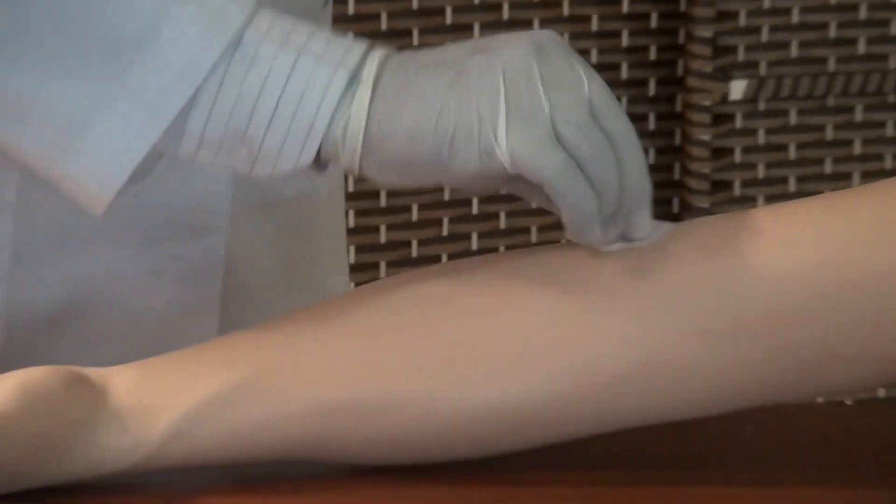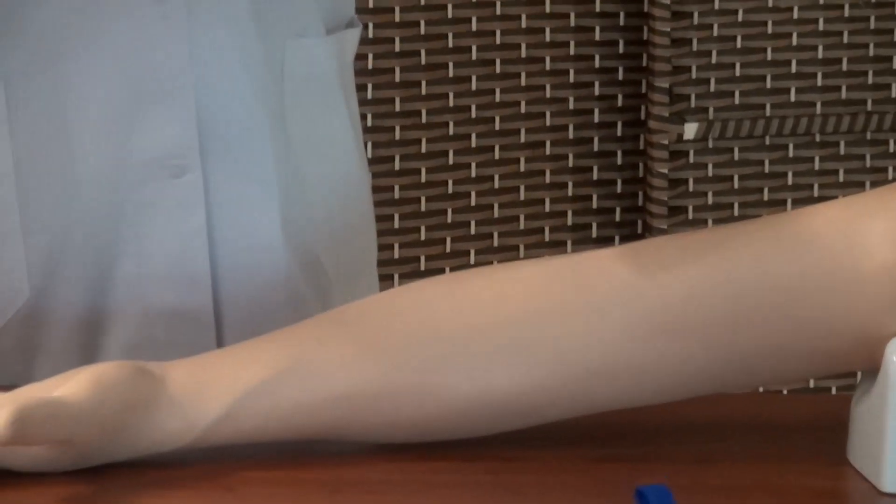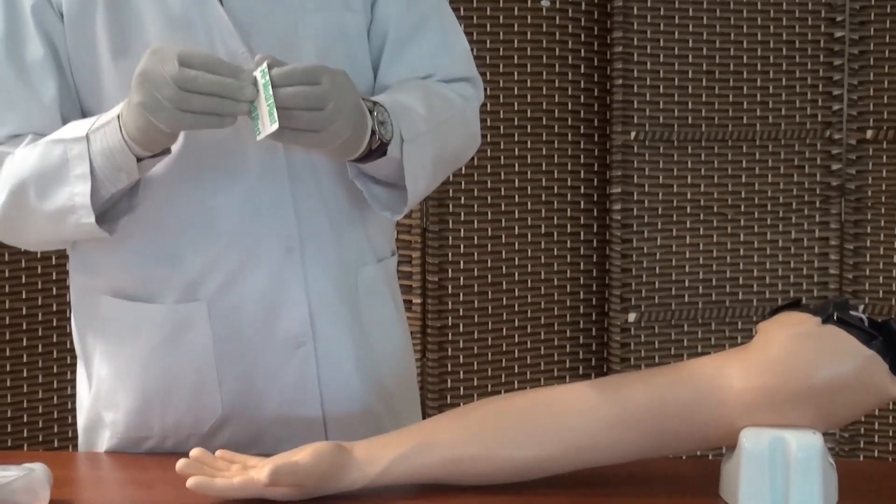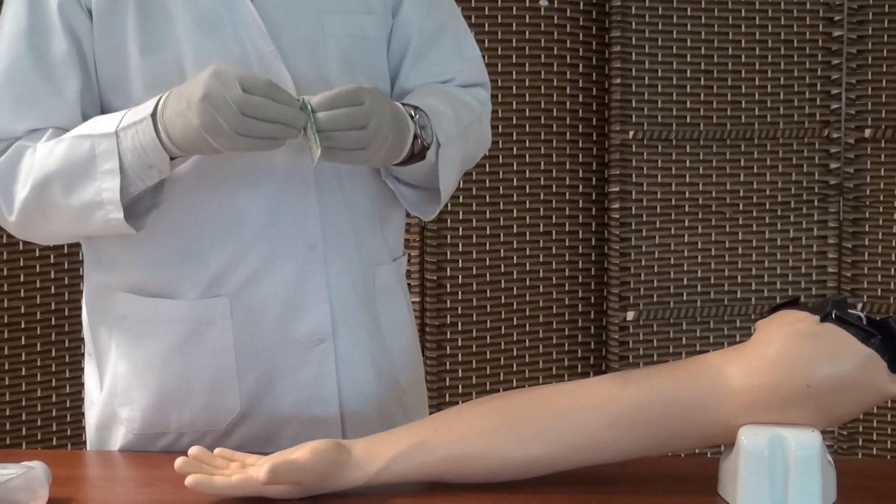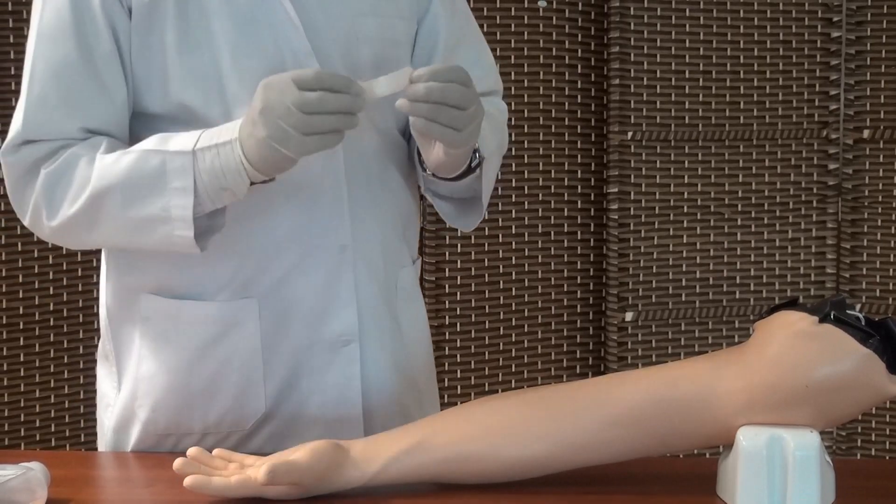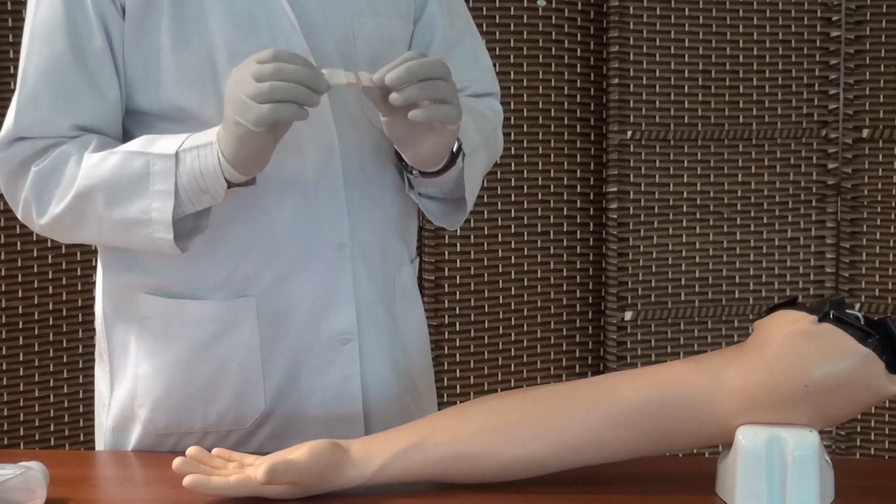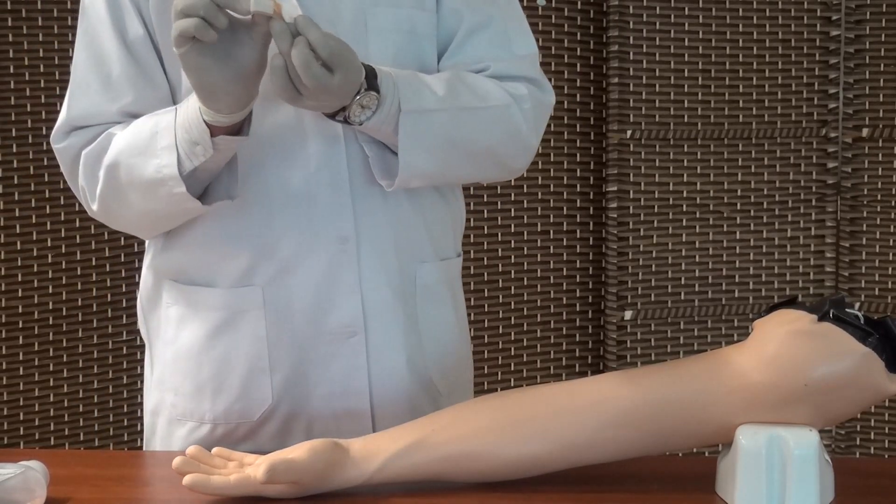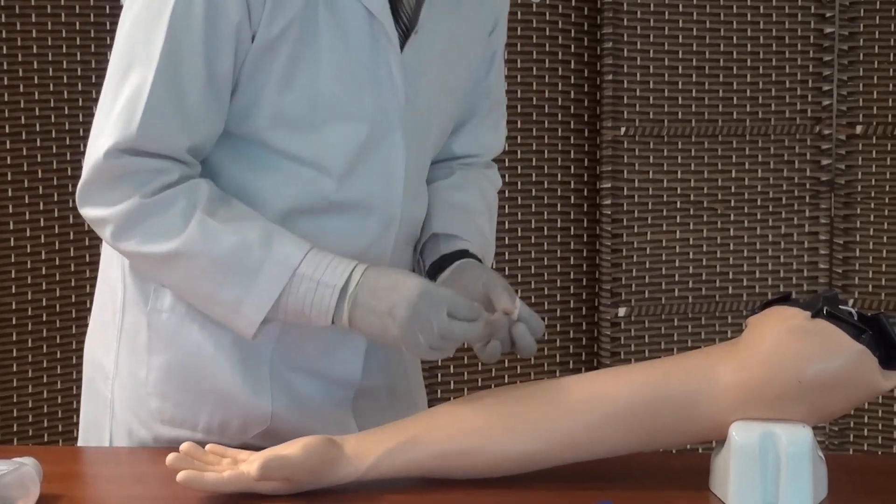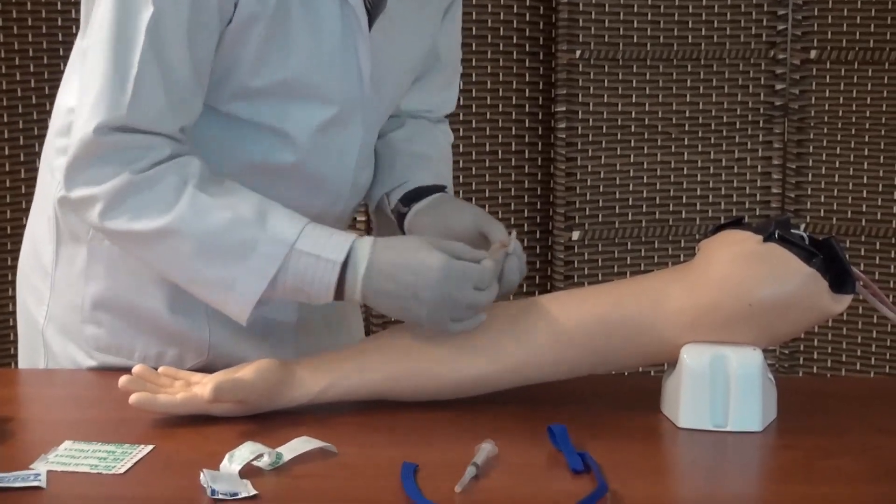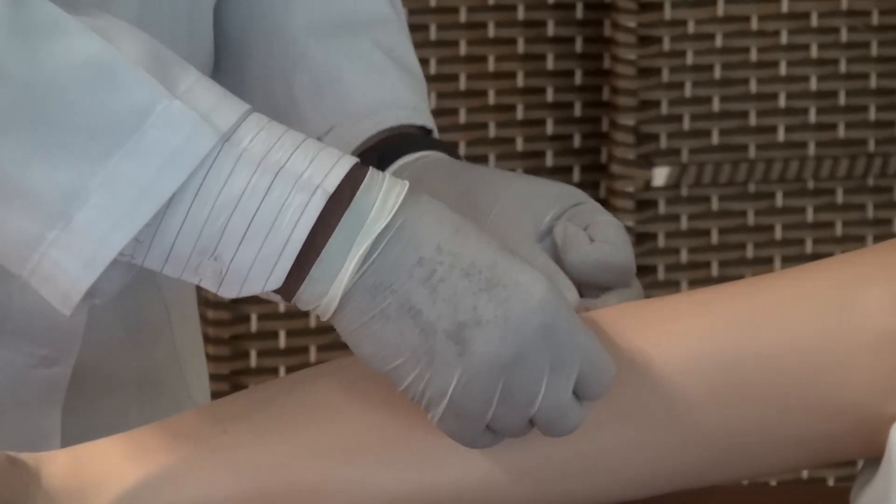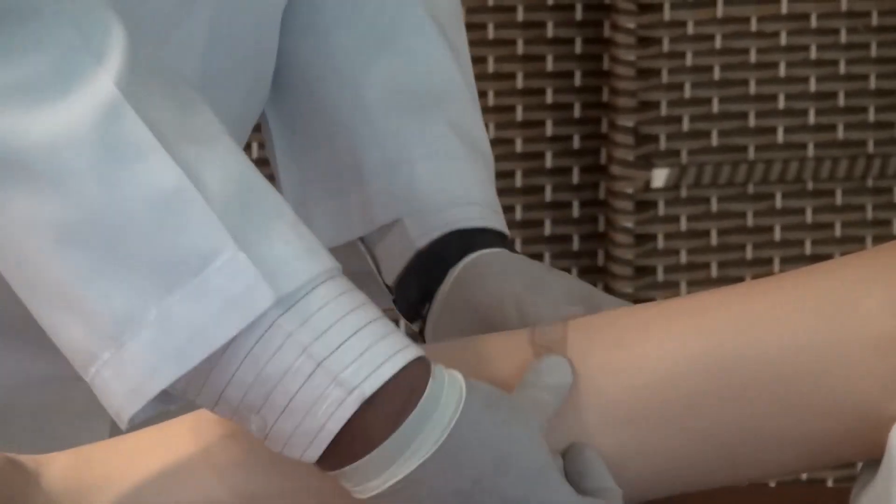You can take out one of the bandages, avoiding touching the cotton pad. As you could see, there is a cotton pad, so don't touch the cotton pad. That was the point of entry. We will just apply the cotton pad here. And here you go. Thank you very much.